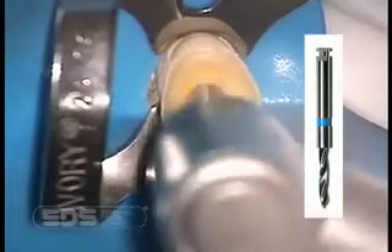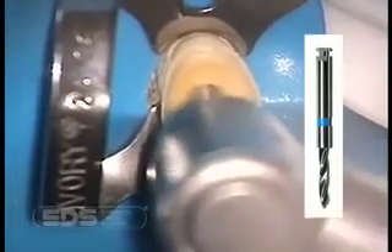We are using the number 2 size blue primary reamer from the Flexi-Flange post kit. When drilled to the stop, this will give us the exact post hole length for the full length of the shaft.